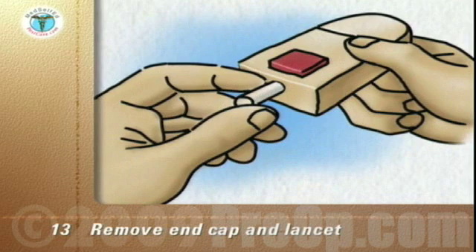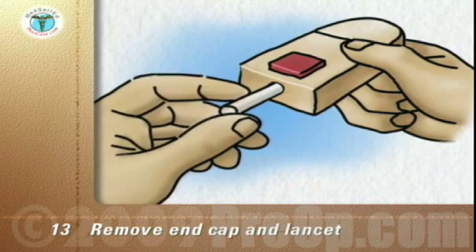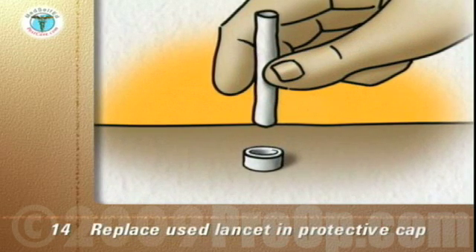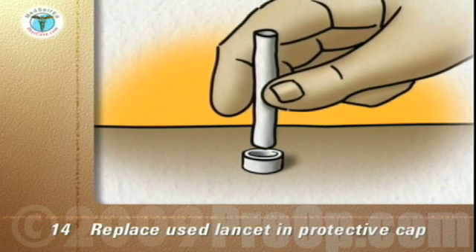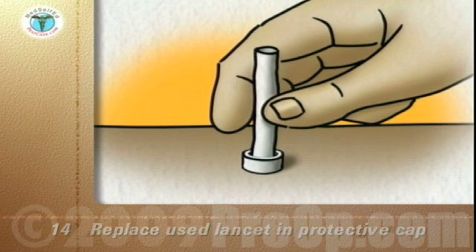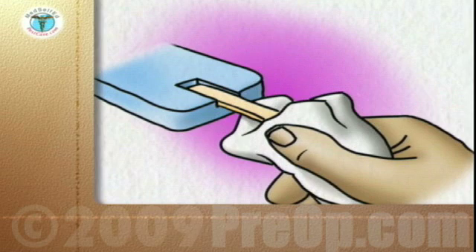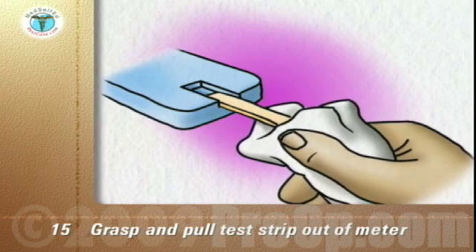Remove the end cap from the lancing device and remove the used lancet. Replace the used lancet back into the protective cap by pushing it into the open end of the cap, which is placed on a firm, flat surface like a countertop. Once the blood sugar reading on the meter is complete, use the tissue to grasp the test strip and pull it out of the meter. This usually turns the meter off.